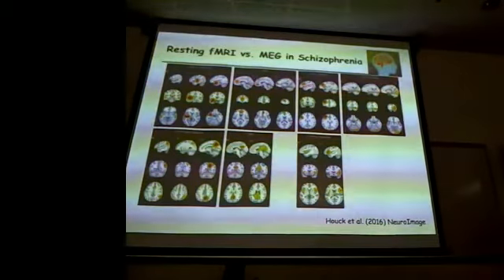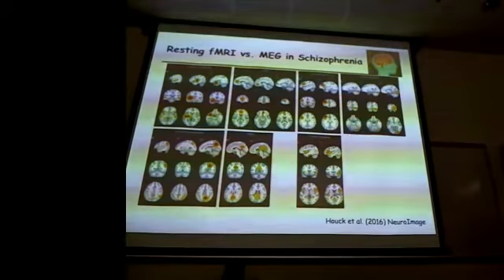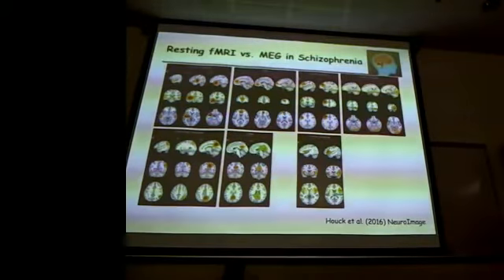Yeah, so this was run through ICA, and it turns out that in a lot of cases, the auditory cortices aren't really synchronous in MEG, right? So when you have higher temporal resolution, then you can actually parse that apart. It's separated into two separate components. That's kind of an artifact of the ICA. Not necessarily, as long as you still get the two components, then it's not really an inherent difference, I would say.